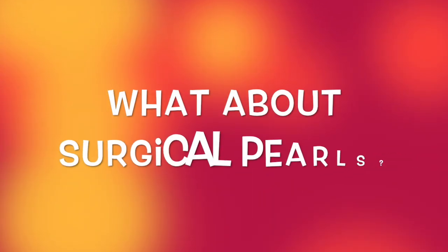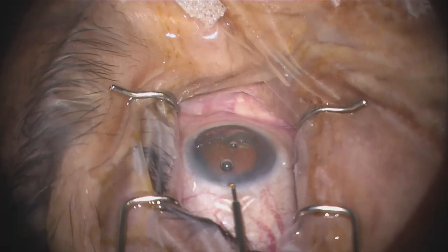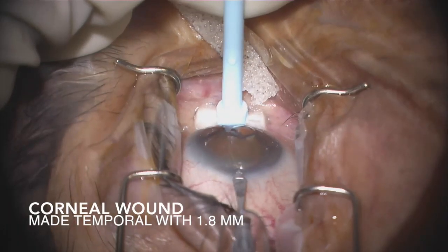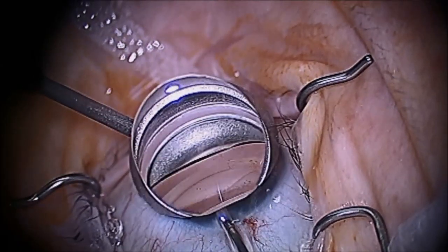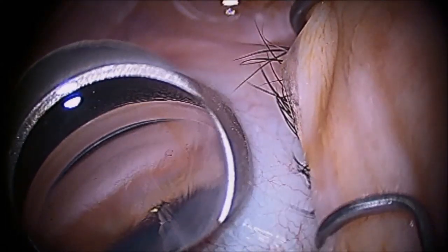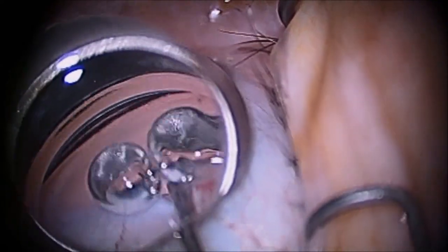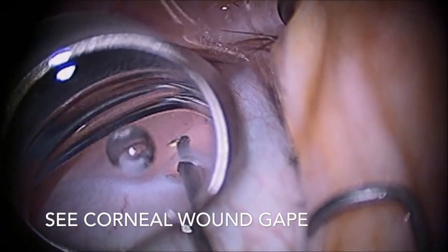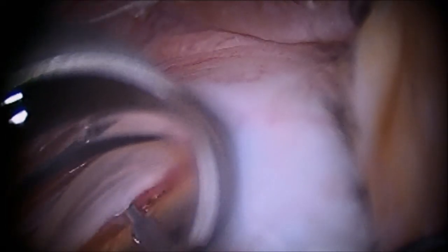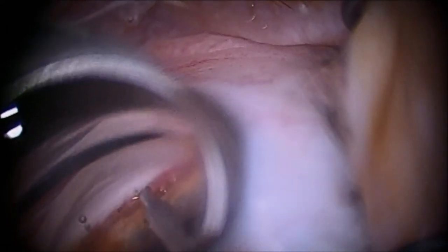Now, some surgical pearls. One pearl is that if you choose to do a combined Trabectome and cataract surgery, it is best to do the Trabectome first. The fluidic system works best to maintain the anterior chamber when the 1.8 millimeter corneal incision is used. If a 2.2 millimeter or greater corneal wound is made first for the cataract surgery and the Trabectome handpiece is used in this larger incision, there will not be a good seal around the handpiece and fluid will leak out, causing a shallow chamber, corneal folds, reflux of heme when the TM is penetrated, and a poor view. This makes the surgery much more difficult.